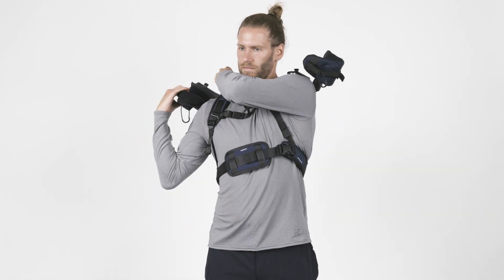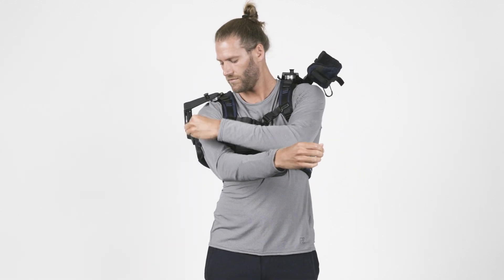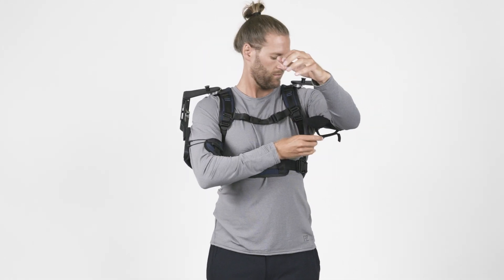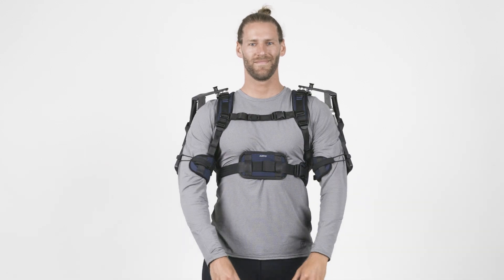As you can already see, using the DeltaSuit is easy. With a bit of practice, it can be donned, adjusted, and used within 30 seconds. Once you wear it, it will automatically provide support when lifting your arms.